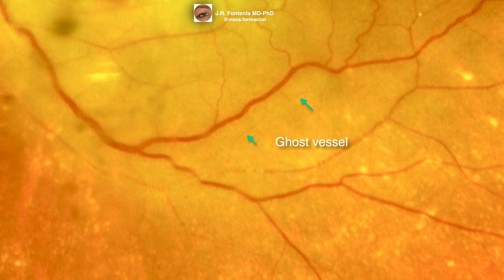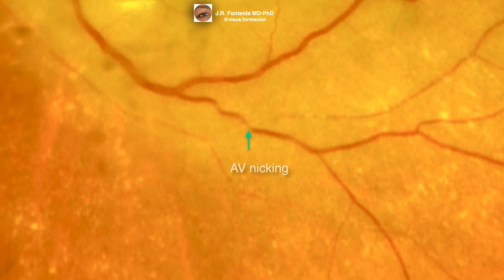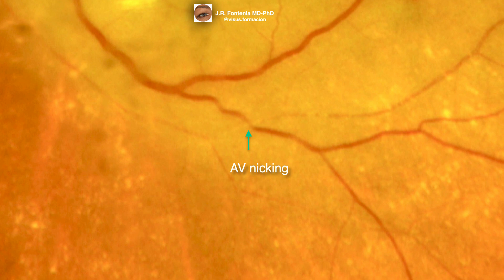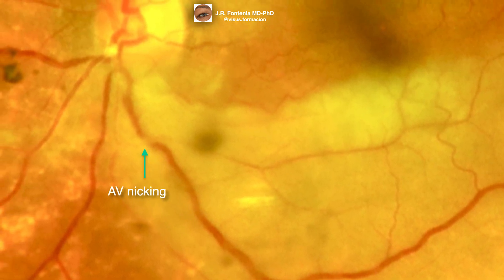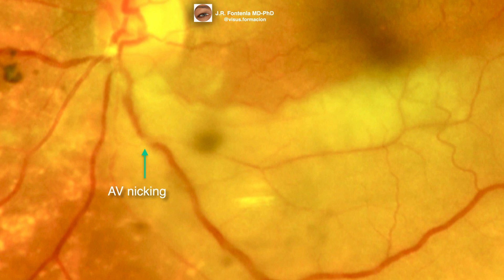We can also find completely bloodless vessels — the ghost vessels. In this area, we also see a pathological arteriovenous nicking. And in this more posterior area, closer to the optic disc, we can also see another arteriovenous nicking. Both are related to the underlying hypertensive retinopathy in this patient.